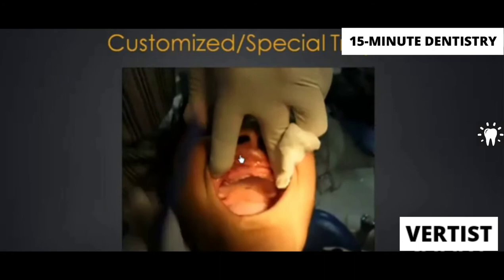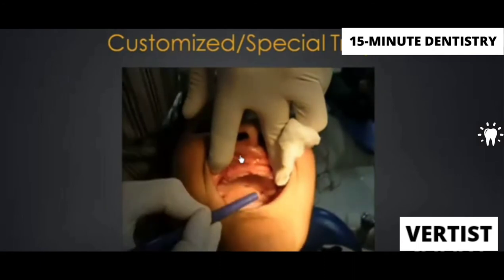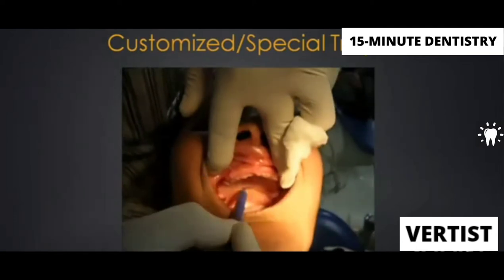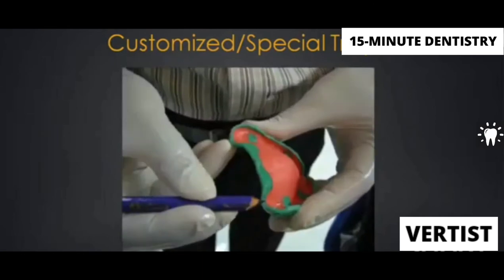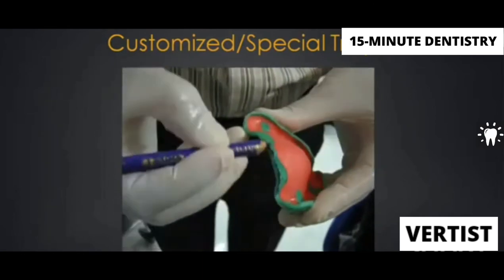Okay, so you mark, you connect all these three points, and then what we do is we transfer it on our custom tray. We place the custom tray in the patient's mouth and we transfer it. And then we check whether our posterior most extension is correct or not. Okay. Sometimes when we transfer it, we are not able to see it on the custom tray correctly. So we are not able to judge correctly.